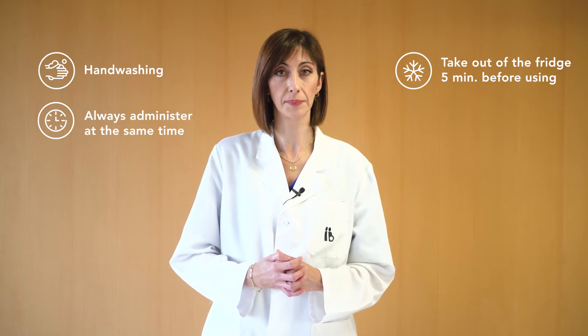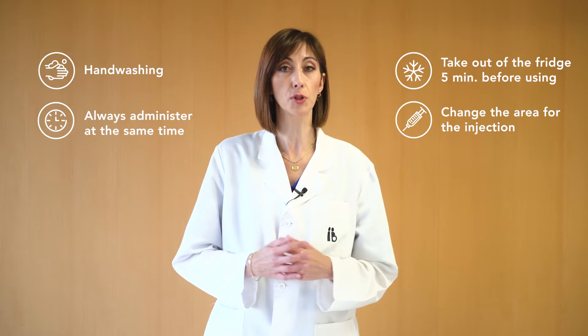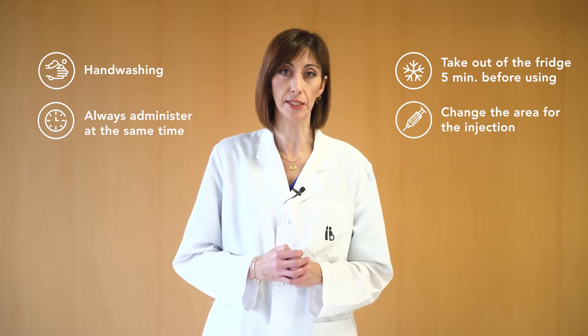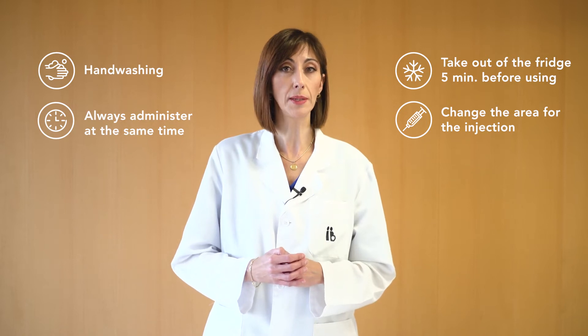Ensure that you take the medication at approximately the same time every day. The next time you take the medication, ensure that you administer it in a different area in order to improve absorption and reduce pain.